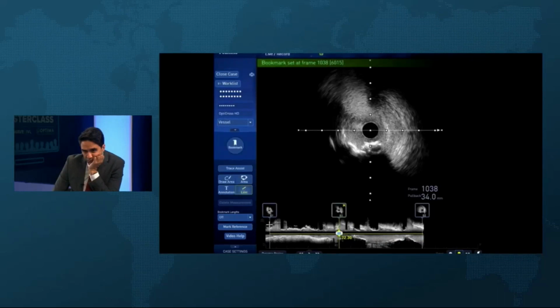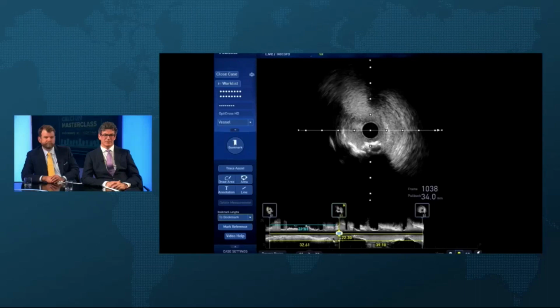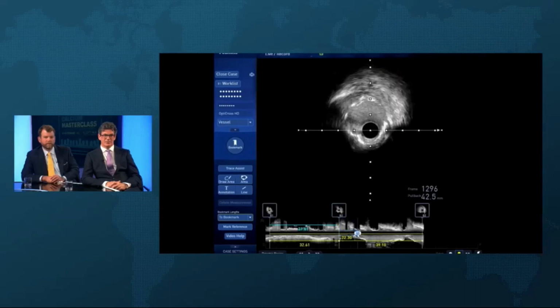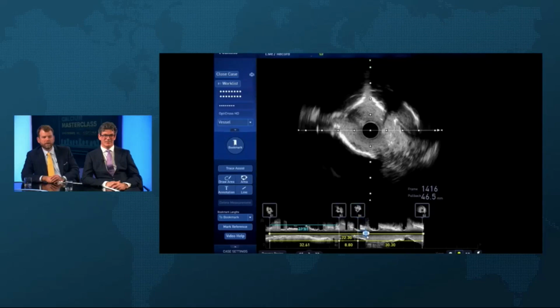and I measure that. If you just click bookmark lengths at the bottom, Margaret, it'll do it for you. Okay. So if we landed distal to the aneurysm with the first stent, we're looking at kind of 28, 32 region. Or if we came more proximally, it's about there. Because you're going to be 1, 2, 3, 4. So that's going to be 40. So if we took a 40, it's probably going to be about here.